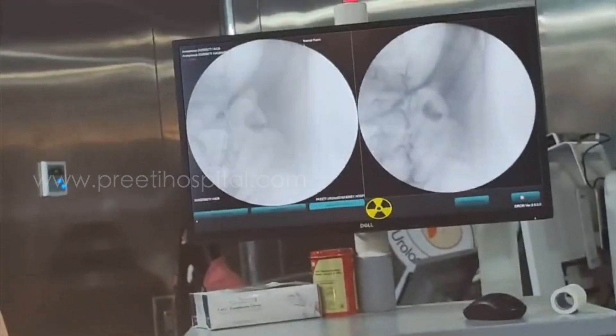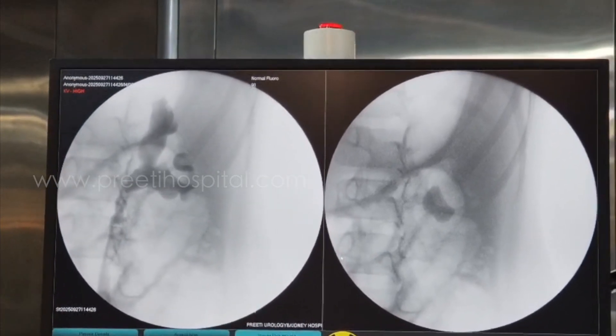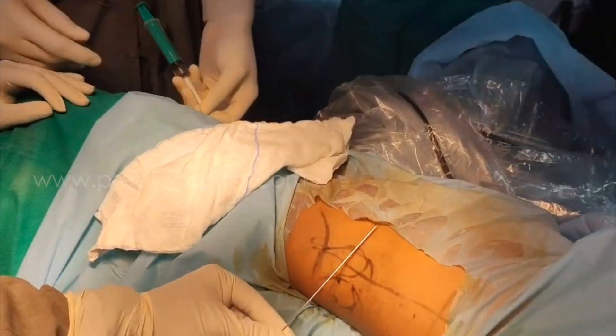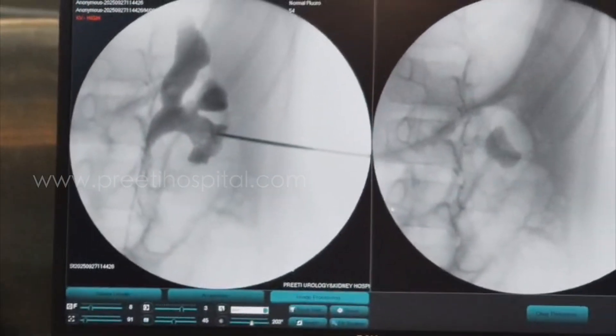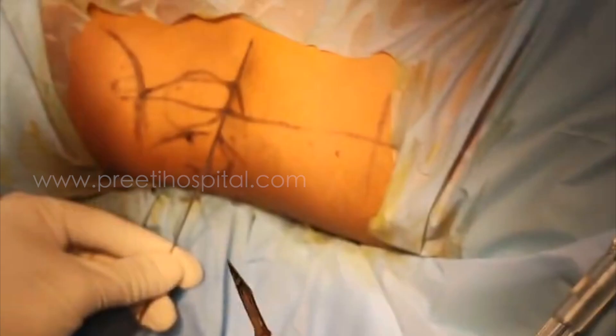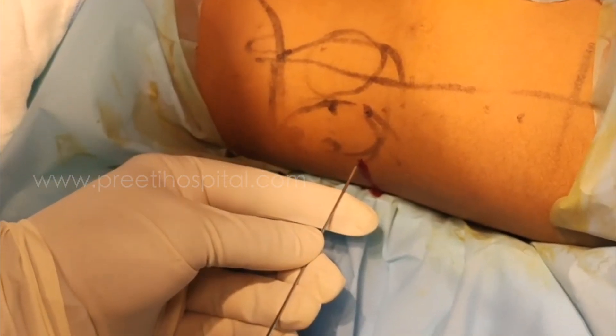Is there any lateral component? I will check that slowly. Slowly inject contrast — injecting now. I can very clearly see the lateral calyx. It should be above my iliac crest — yes, it is. Way above, as I showed on the CT. Now, where should I put my needle? First, below and posteriorly — here. Now I am going horizontally; it will be just below the skin in children. Can you see it is moving? Yes.